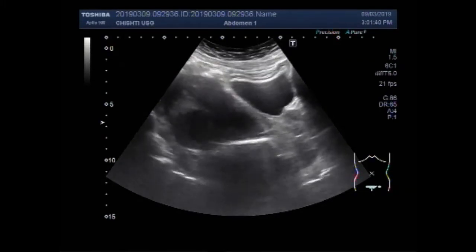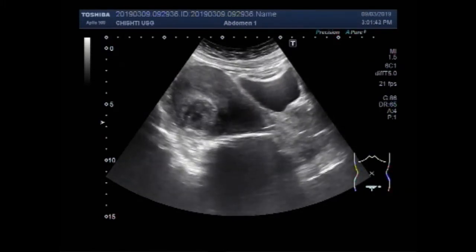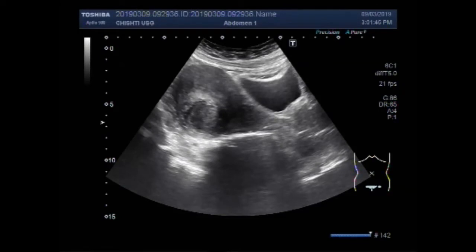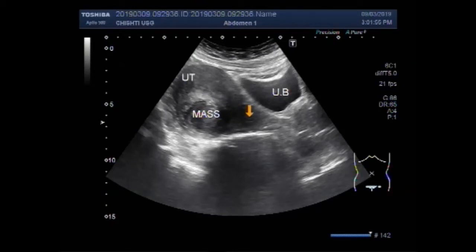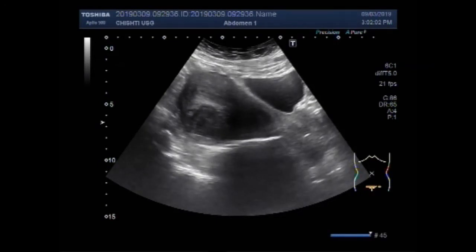This ultrasound video shows a uterine mass. You can see this is your bladder, this is the uterus, and this one is the mass in the posterior wall of the uterus, in the middle portion of the uterus near the posterior wall.